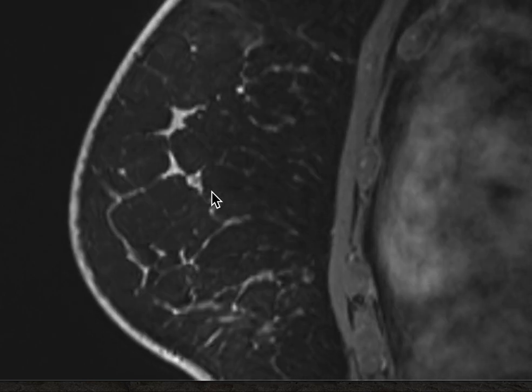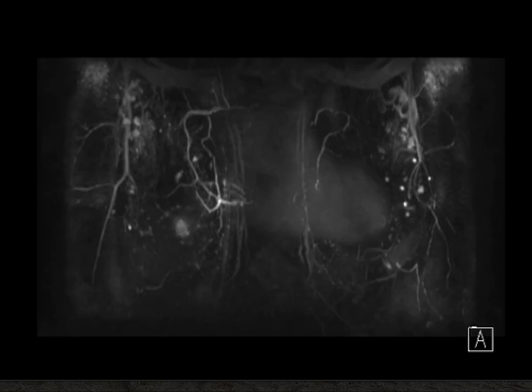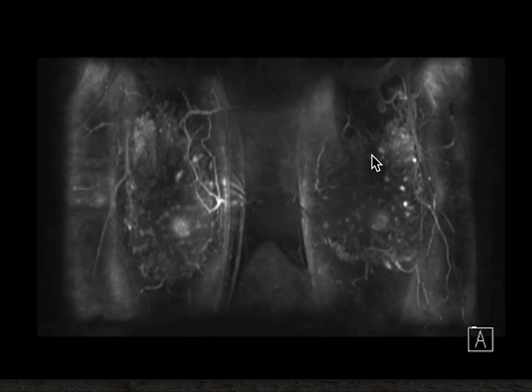If you have someone who is high risk, you're going to be reading that a little differently than someone who is cancer staging. With high risk, you have a higher threshold for calling back, which means something has to be abnormal for you to call the patient back. If it is for cancer staging, I think I have a lower threshold of calling somebody back. And some of the things that you have to put in your report are, of course, size.